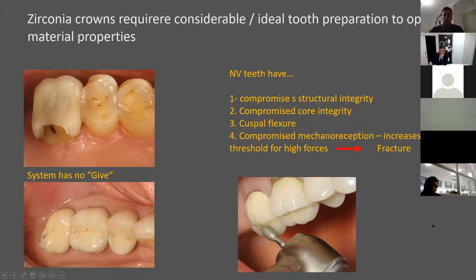So I am recommending non-zirconia based materials. I understand that everyone's going zirconia for whatever reason, but it's not good in a bruxer, guys. When nothing happens, all the other teeth wear, and zirconia stays the same from day one to day X. It is better for porcelain to chip. It is better for gold to wear, and these crowns adjust according to the bite.